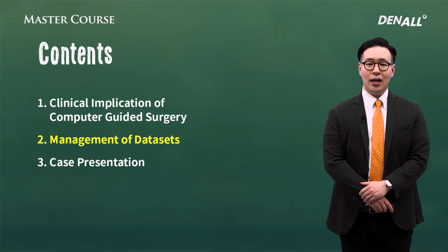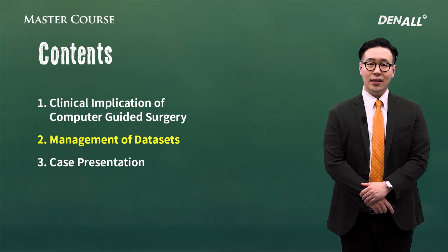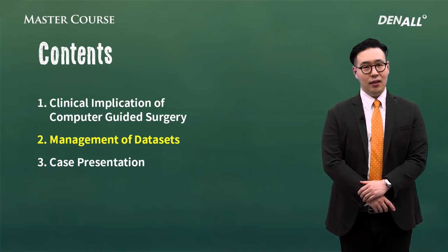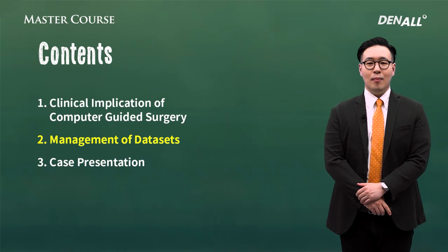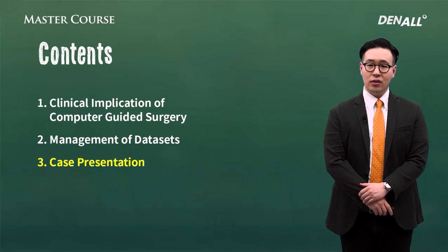Next, if the guide template is not accurate, sometimes errors can occur. Therefore, a guided template that can be used safely is the most important thing. Then, CBCT data and the surface scan of a patient should be merged together properly. Today, we are going to look at how to manage the data set. Lastly, what would be the proper indications in the basic level? And let's look at what are the big benefits that it can bring.